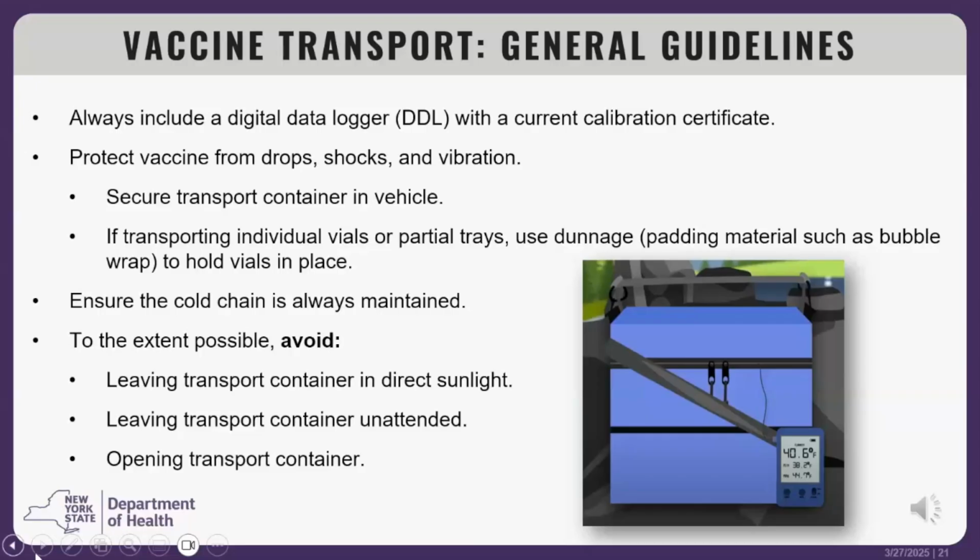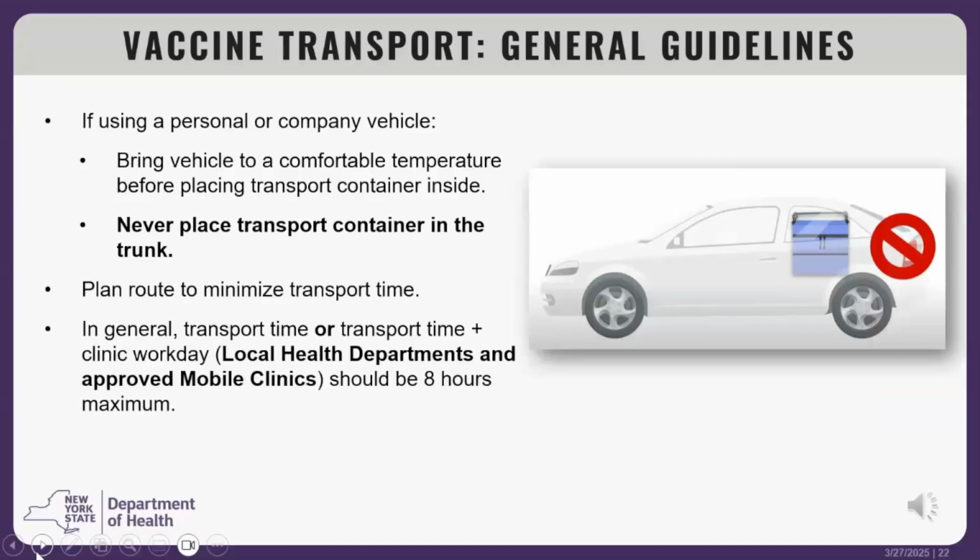If using a personal or company vehicle, bring the vehicle to a comfortable temperature before placing the transport container inside. Never place the vaccine transport container in the trunk. Plan your route to minimize the transport time. In general, the transport time, or the transport time plus the clinic workday, for local health departments and approved mobile clinics only, should be 8 hours maximum.